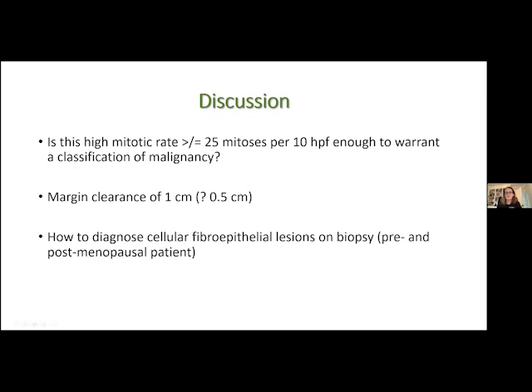And just in terms of the core biopsy, Sylvia, for these, if I see mildly hypercellular stroma on a core, but none of the other features that would make me concerned about phyllodes, I'll call it a fibroepithelial lesion with mildly hypercellular stroma and say that I favor fibroadenoma. The patients will be followed for a bit.